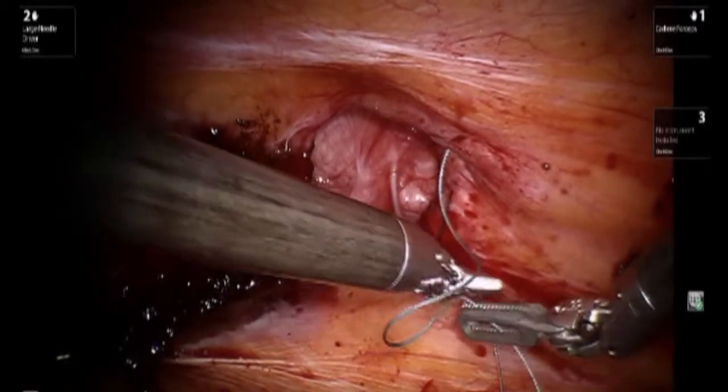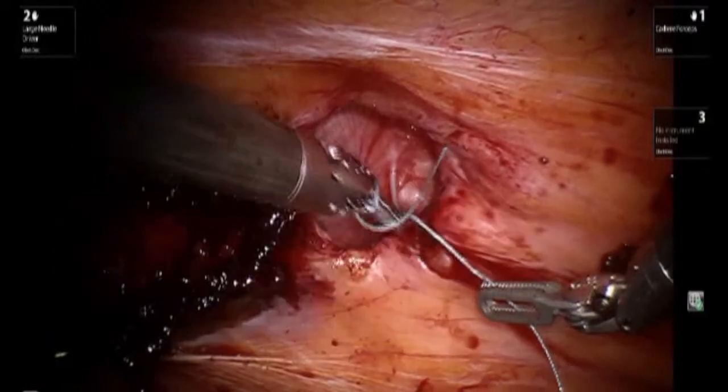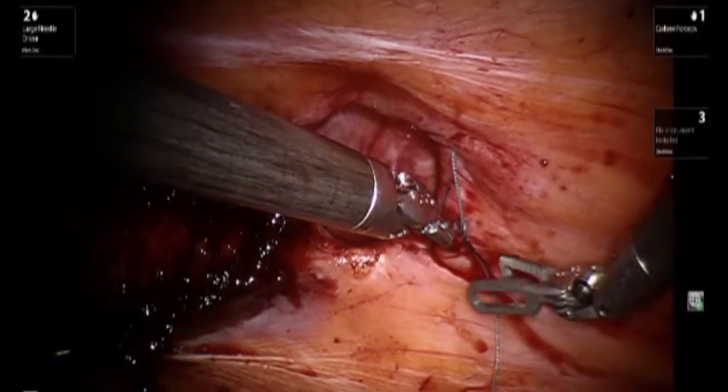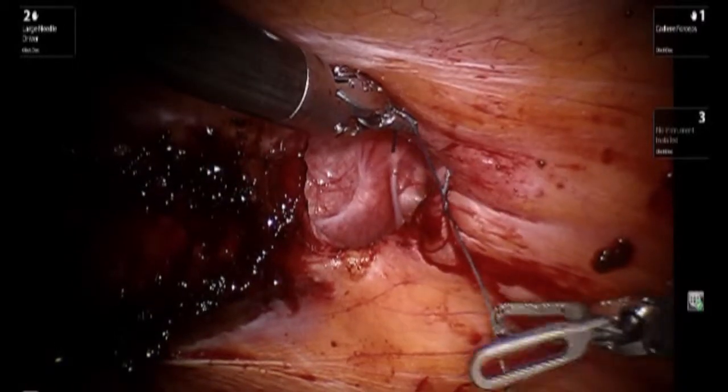While doing this part of the case, it is very useful to reduce the intra-abdominal pressure. Normally we drop the pressure to approximately six. This allows for the fascial edges to come together with less tension.